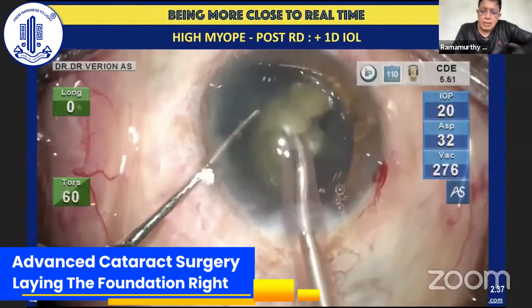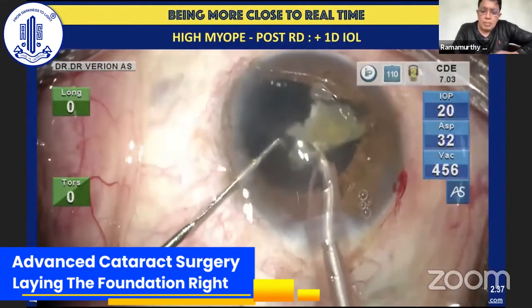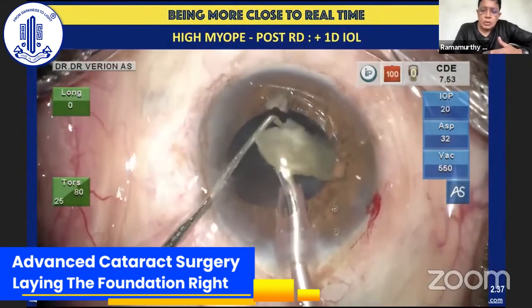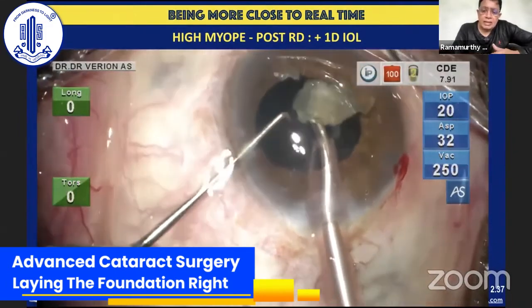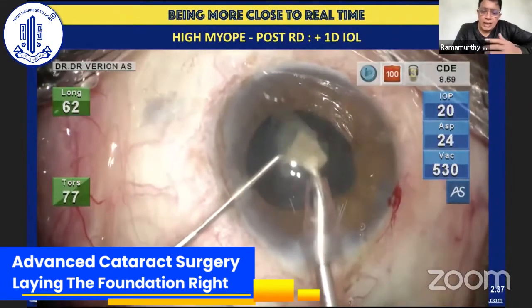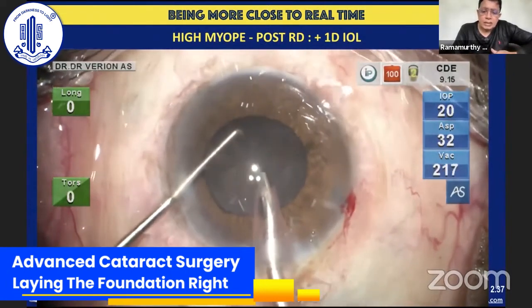As has been emphasized repeatedly, it's not really necessary to go on to a vacuum of 600 or 650 in each and every case. But the combination of these techniques allows you, depending upon the surgeon and the way he is used to treating cataracts, to use even low intraocular pressure, so that you enjoy the benefits of that. At the same time, use a reasonable amount of aspiration vacuum, which makes the entire process of cataract surgery more efficient as far as the amount of energy going into the eye is concerned, safer, and leads to clearer corneas on postoperative day 1.